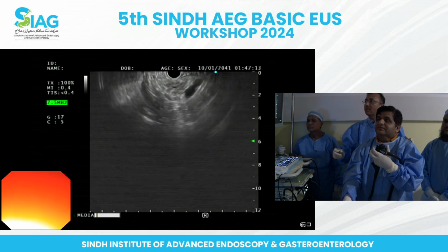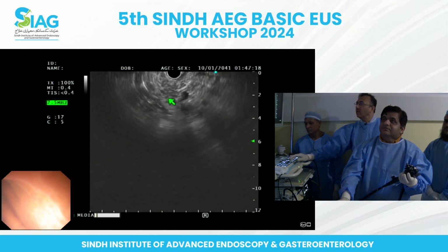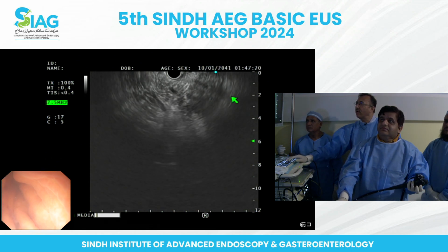Tip up and clockwise rotation. Here we have the left kidney. Over here we are going to find the spleen.